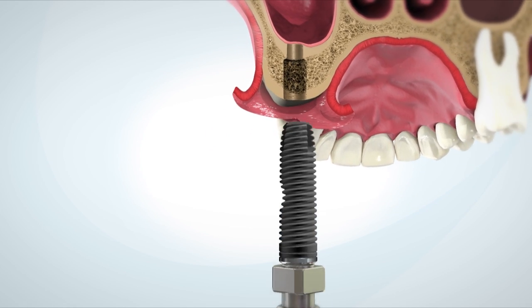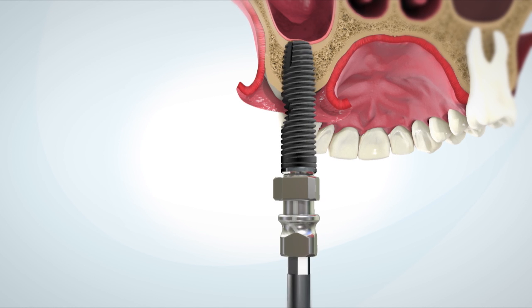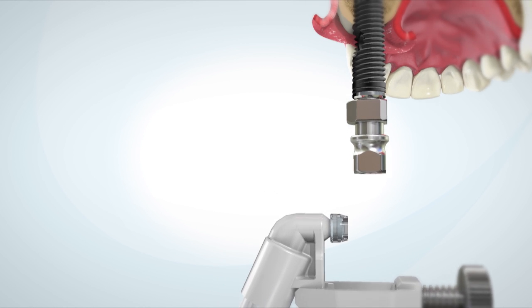Insert the implant until the end of the osteotomy. Assemble the tube connector on the implant.